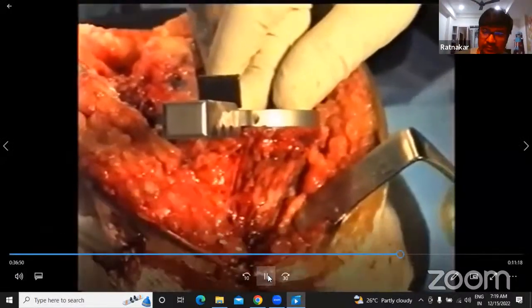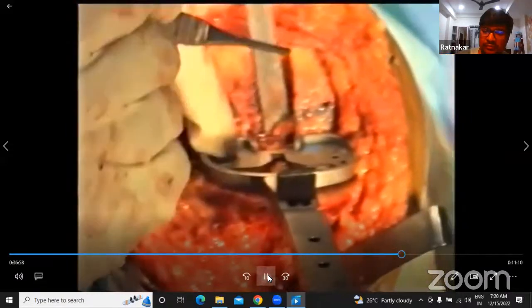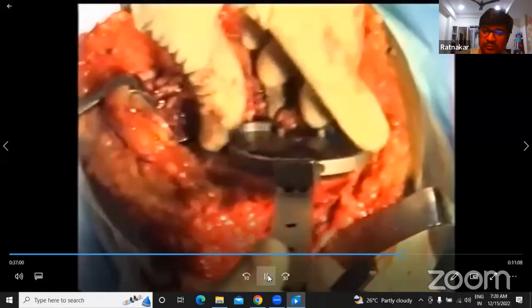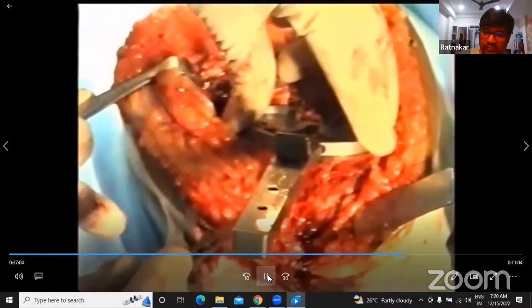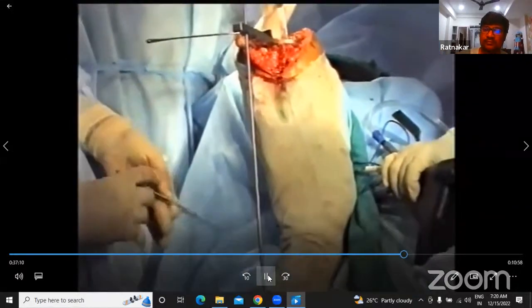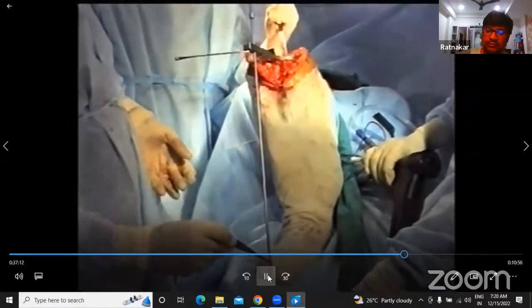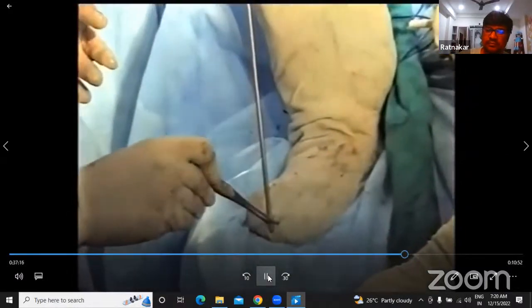One-third of the tibial tuberosity. Sometimes we tend to put too much into internal rotation because this tibial base plate sits nicely on the tibia. But you should resist that. The only reference point for putting this here is exactly medial to the tibial tuberosity, full stop. This is an extra reference point: this rod should go and touch the first web space. You can see here, that is the first web space.